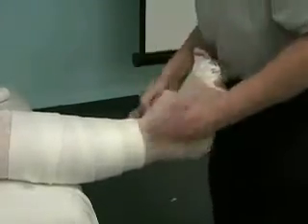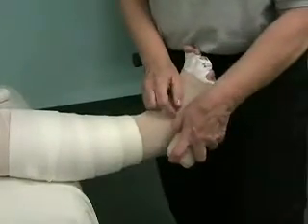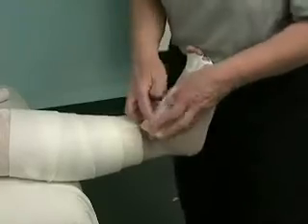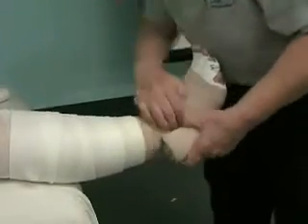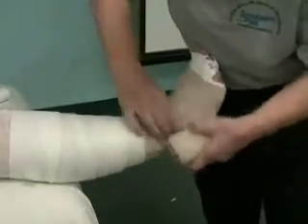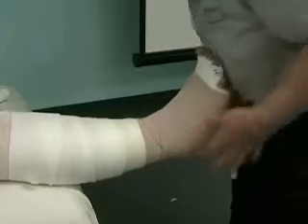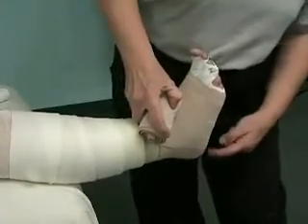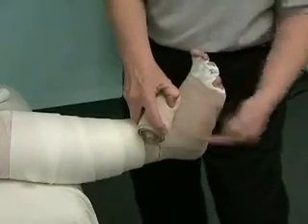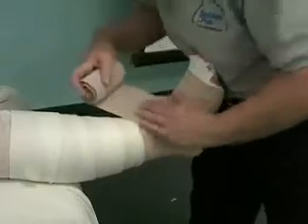Now come down and see, now I have the ability to catch it so much easier than with the 8, because I still have plenty of bandage to continue. Low here. It makes a much better bandage. And now I can lock that heel in. And I still have plenty of bandage. See the window? Much better for me now. I still have a lot. Instead of worrying about running out of bandage, I'll be able to really go on up.